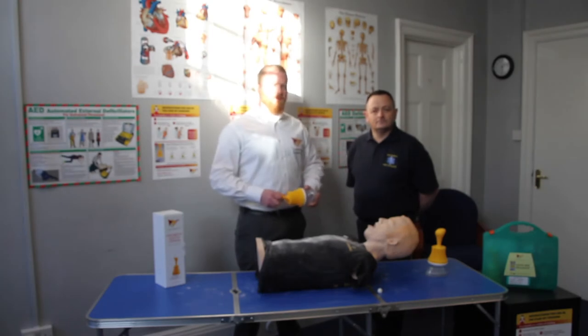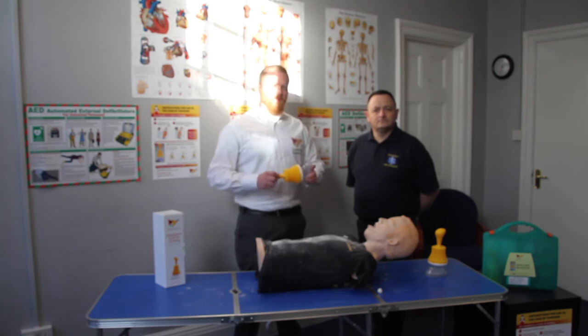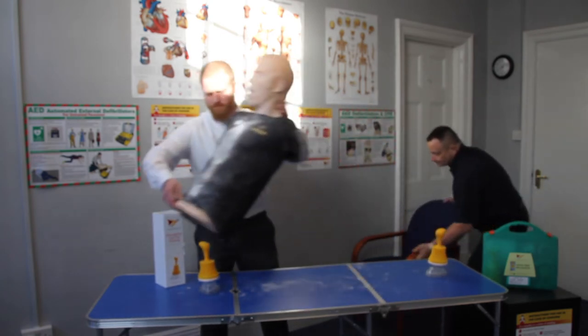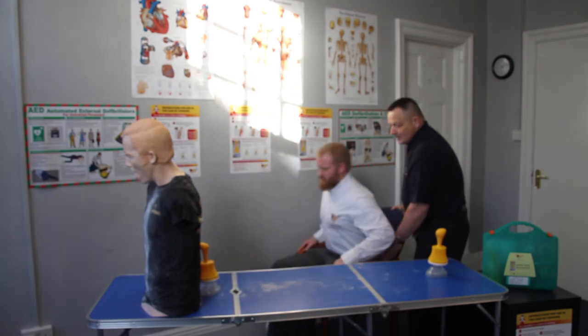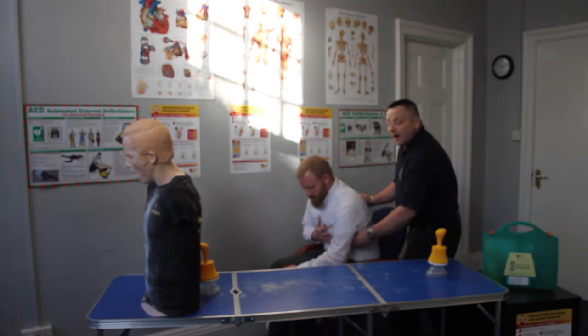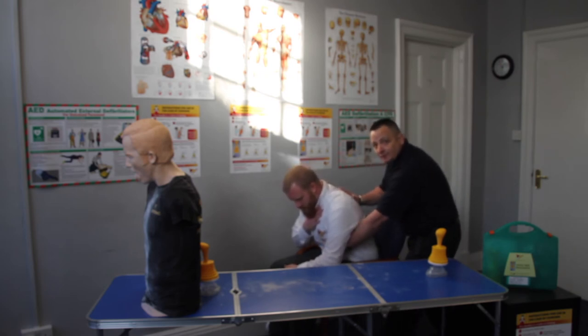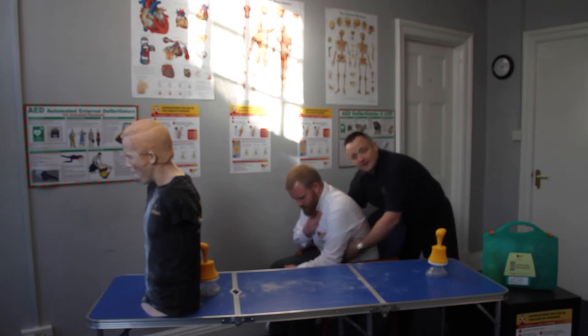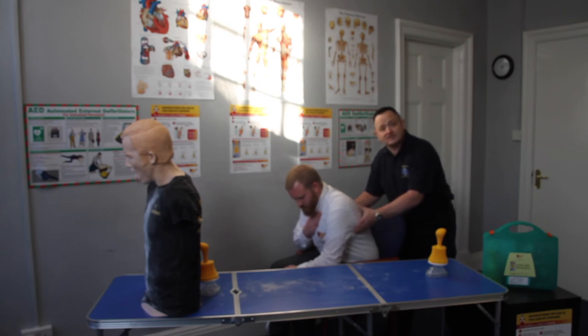We should now demonstrate the BLS choking protocol and how and when to use LIFEVAC on somebody with a disability, a wheelchair user, or in a sitting position. It's important to establish if the person is choking — ask the person to cough. Support them by leaning forward and deliver up to five back blows — hard, sharp, fast blows between the shoulder blades — encouraging them to cough and checking to see if the blockage has been removed. The problem is, if this is a wheelchair user, someone in a high-backed nursing home chair, or somebody unable to support their own weight, doing the abdominal thrust becomes extremely difficult. So at this point, if the person has unfortunately become unconscious, I will need the assistance of the emergency services by calling 999.